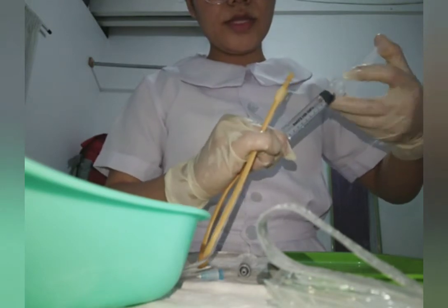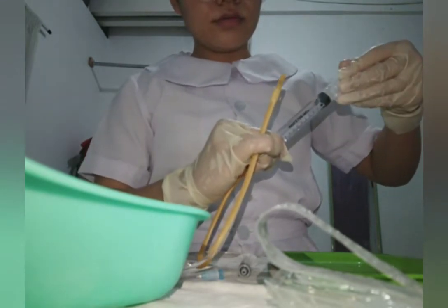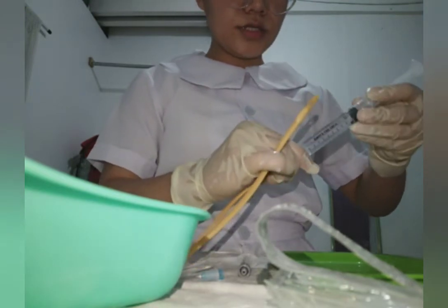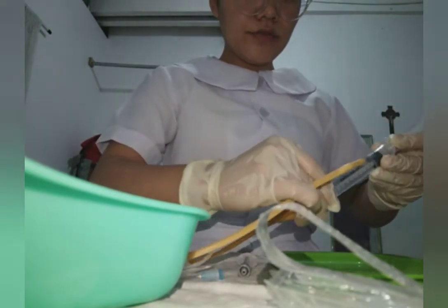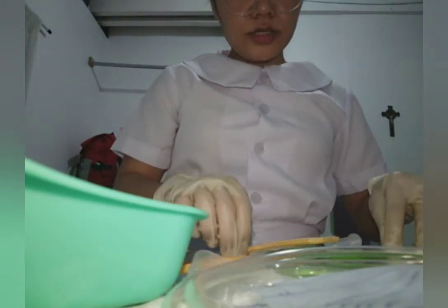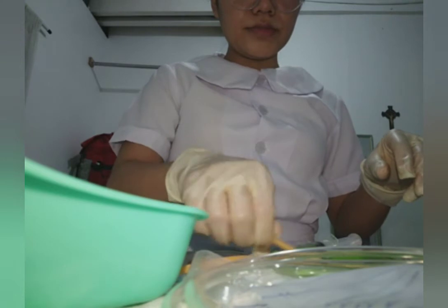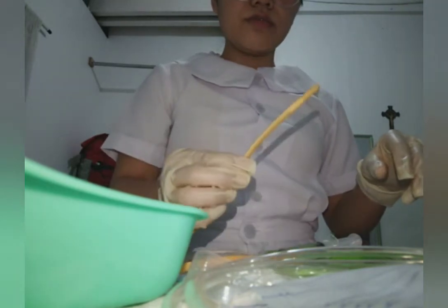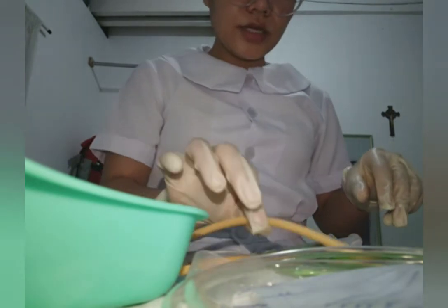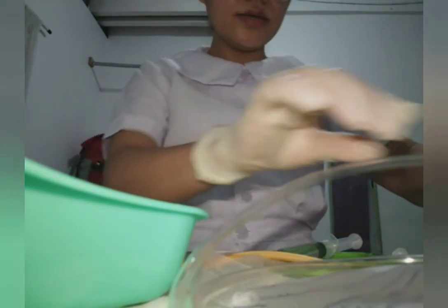So it's inflated again. I will deflate and remain attached to it till I finish the process. Apply the sterile lubricant to the catheter for the first 2.5 to 5 centimeter, that is 1 to 2 inch, to the catheter tip. Now I will attach the catheter to the drainage valve.